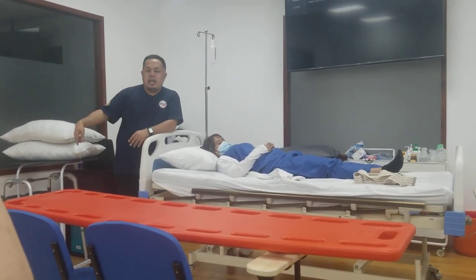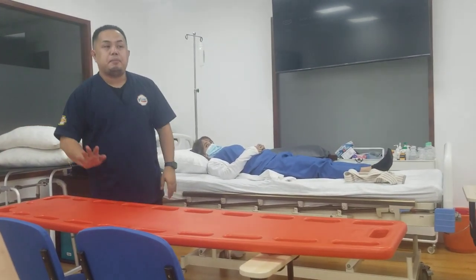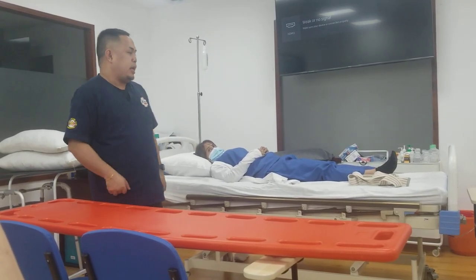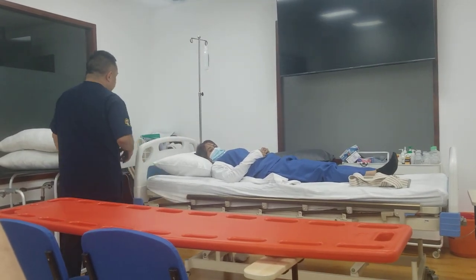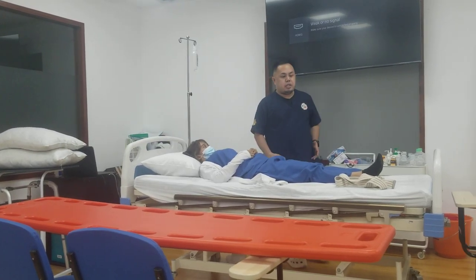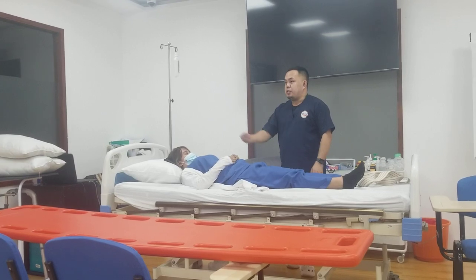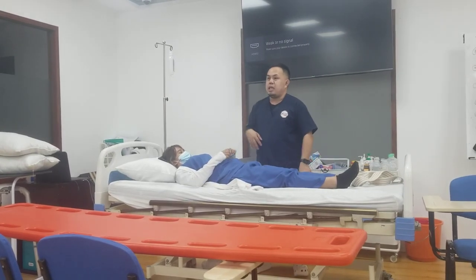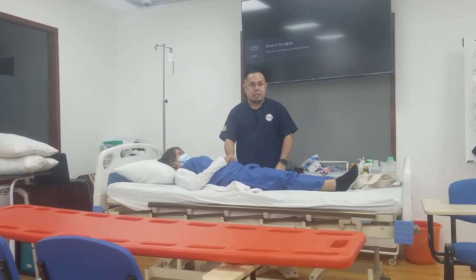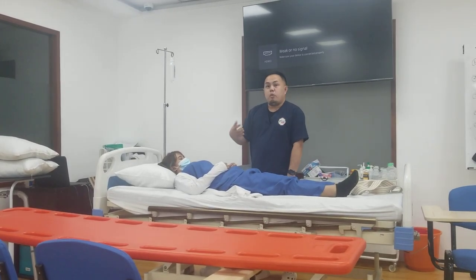Take the stretcher bed with the board and go to the patient's room. Start your conversation — if the patient is new, introduce yourself and identify the patient; if the patient is an existing patient, verify using the wristband. Then confirm the patient is already aware of the procedure.